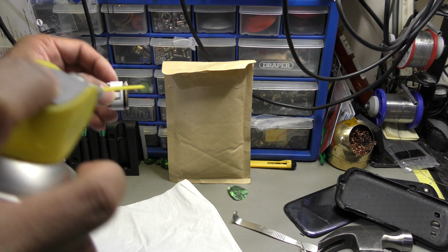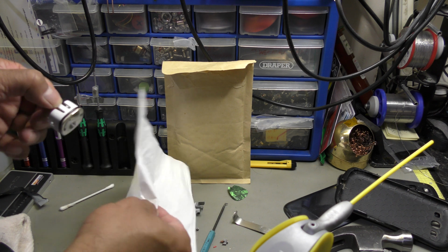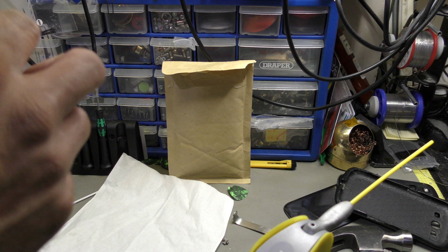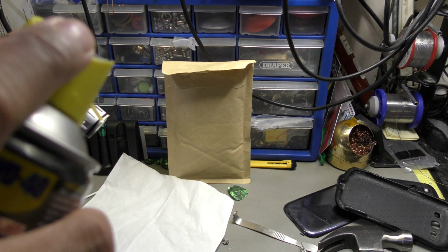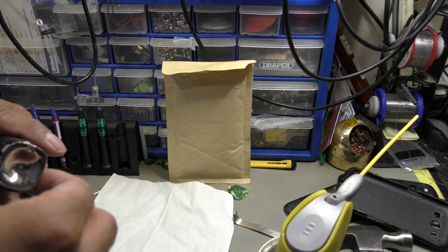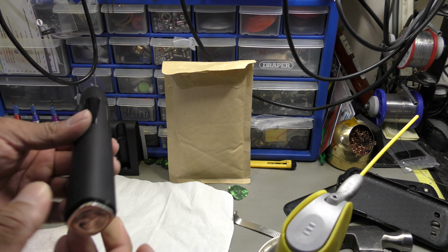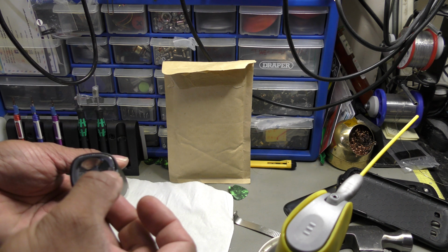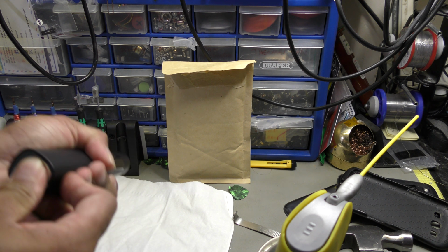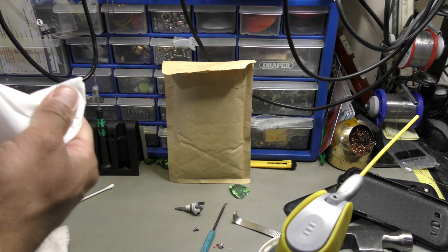You can apply Vaseline, it's no big deal, but I tend not to. And once you're quite comfortable that the area has been lubricated, just put it back in its orientation. Now the little dot here, I put a little marker there on the back end of the unit itself, as you can see here, so I don't forget the orientation. All you've got to do is press it back in again and done. There we go. It's something as simple as that.